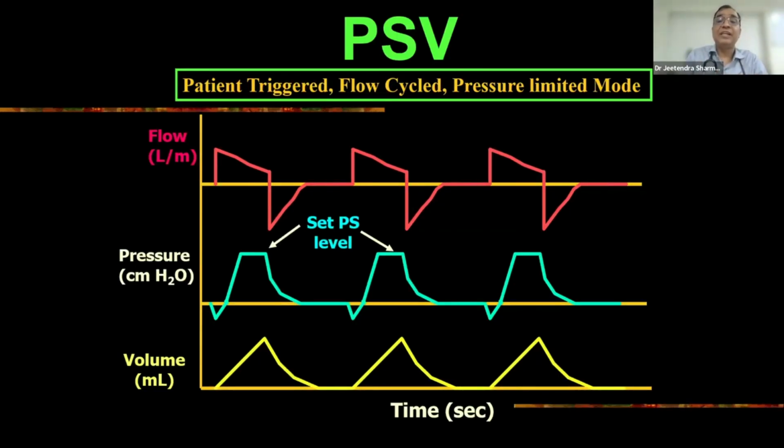So what exactly happened here is, when the breath starts, it's coming from the ventilator through the patient's lung. Once the lungs, which were empty, gradually start filling up, the decelerating pattern goes down. Once the decelerating pattern reaches a certain level, the ventilator understands the lung is almost filled, and it converts from the inspiratory to the expiratory cycle. That's why it is not reaching the baseline 0.